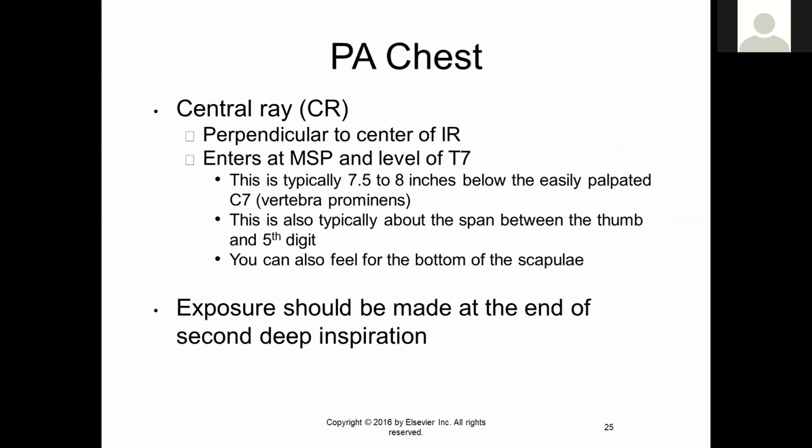The central ray is the dead center of our X-ray beam. It is a theoretical single X-ray in the exact middle of the X-ray beam that travels straight out. This is essentially just our centering point. Where do we put the exact middle of the beam? Every X-ray projection has a point where the central ray will enter your patient.